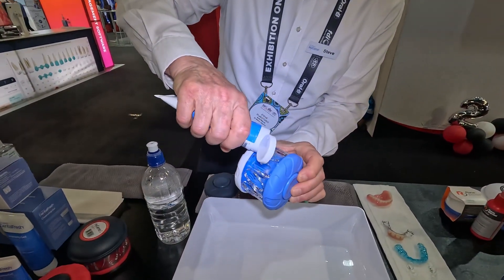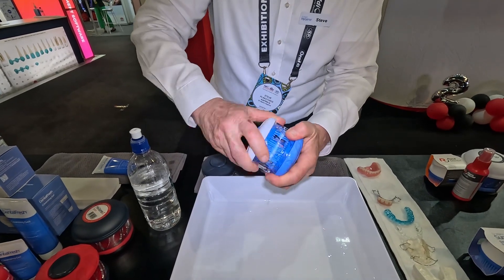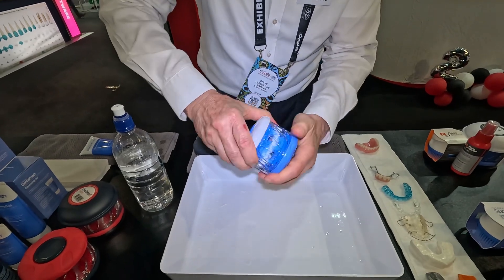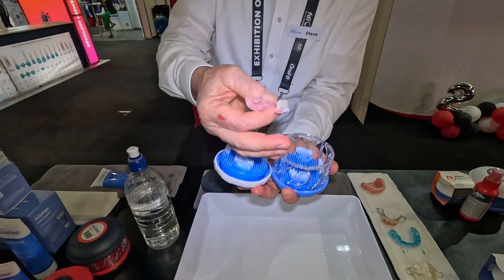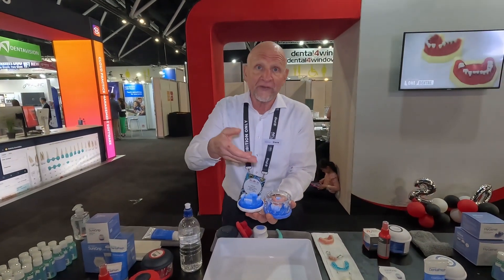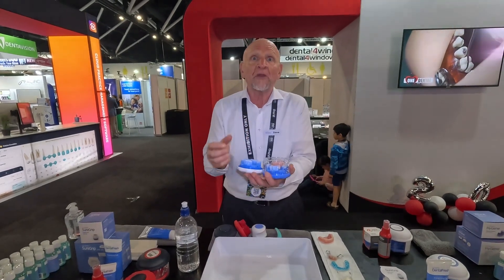Two to three drops of Dental Fresh into the Hygiene and a splash of water from a basin and sink tap, and you simply brush. Gently rotate the Hygiene and you can see within 10 seconds how it starts to foam up. After about 20 seconds of agitation, you can see inside the Hygiene that the dental appliance — in this case a partial denture — has been scrubbed, and the agitation has scooped food particles, biofilms, and bacteria attached to soap molecules up into the Dental Fresh foam.